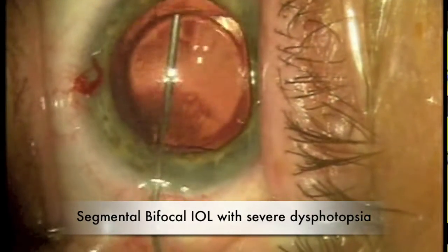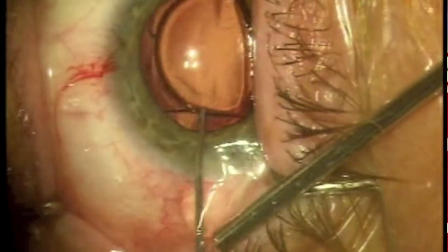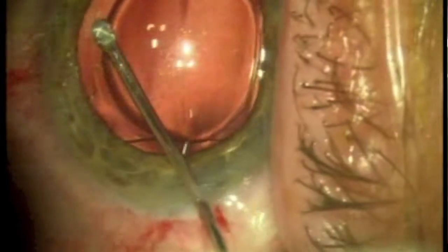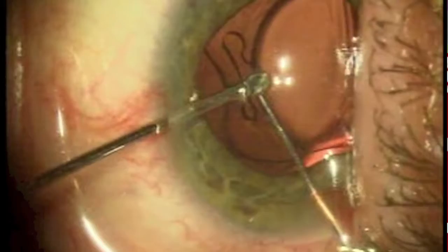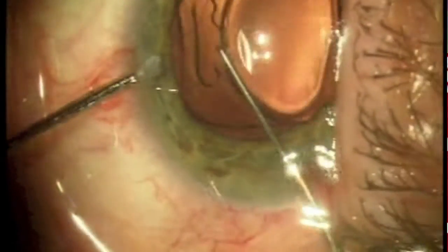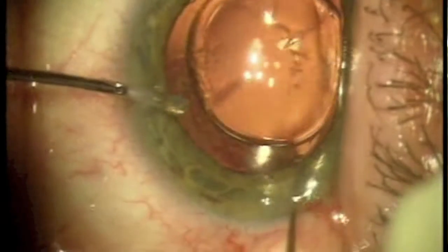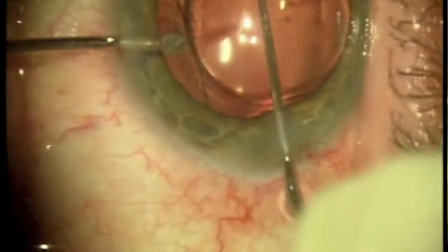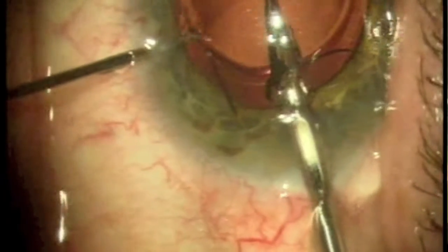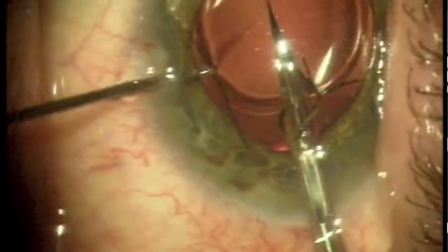In the following example of the explantation of a plate intraocular lens, viscoelastic was first inserted into the capsular bag and the anterior chamber, and subsequently a bimanual technique was used to exteriorize one haptic followed by the other. Once the IOL is in the anterior chamber, it is rotated and orientated such that the haptics are facing the corneal incision to allow complete bisection of the IOL into two separate halves. These are then removed separately.